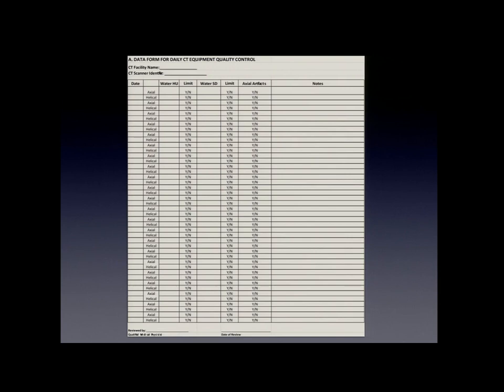So this is the form that the ACR recommends for documenting the daily QC. And you can see it alternates between the axial and the helical.